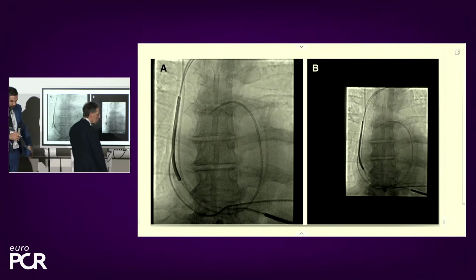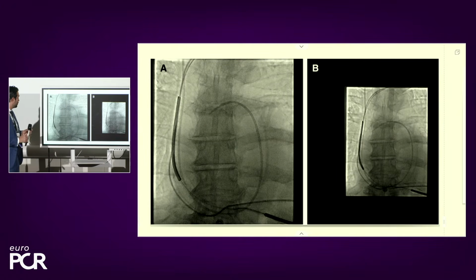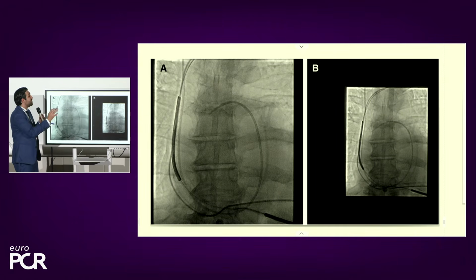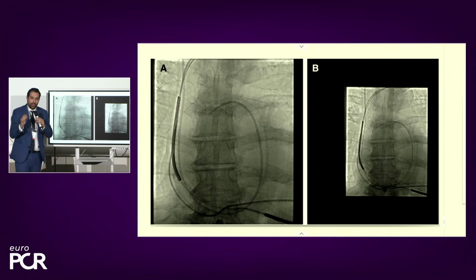This was another concept you were mentioning before, how to limit the radiation. And you were talking about the collimator. Any type of suggestion? Collimation, I think that Hakeem also mentioned, you have to see the stent all the way. So the way that this works practically, at least in the first case we have done, is that we do a test run, only with fluoro, to be sure that the rotation, the position of the patient, everything is okay. And then we deploy the technology, the 3DStent, and then we acquire the angiography. So tips and tricks, collimate, that's very important. And keep in mind that, of course, the BMI plays a role. I think those are the two major points.